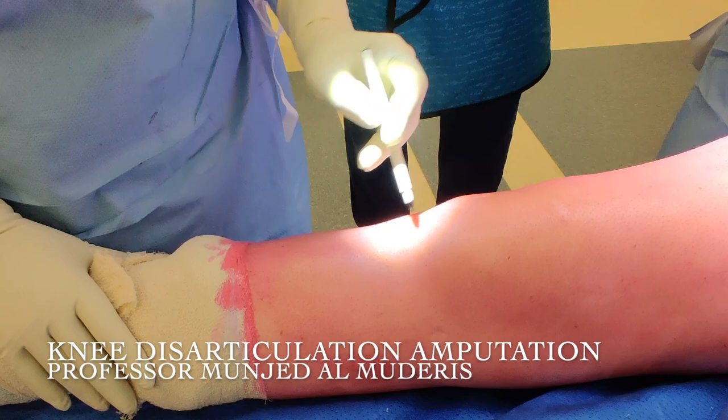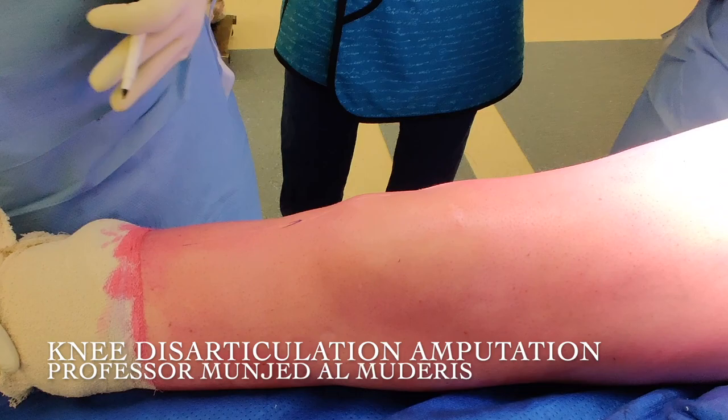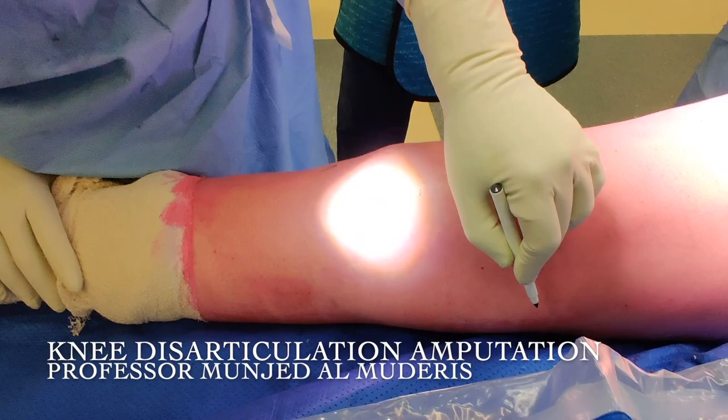This is a male patient who suffers from CRPS. The level of CRPS is at the upper tibia. He has a complex tibial plateau fracture. He had a fracture in his femur, but the area of disability that he has is below the knee. So the plan is to do a through-knee amputation, and I'm going to take you through a proper through-knee amputation procedure.